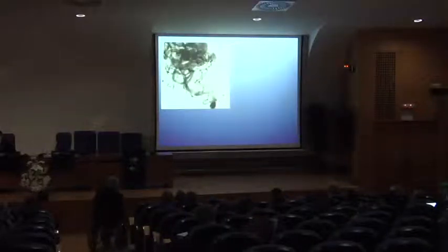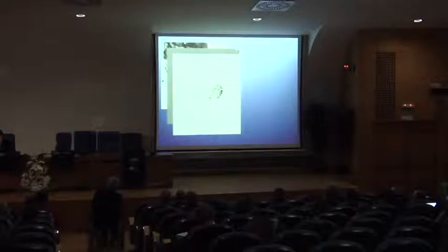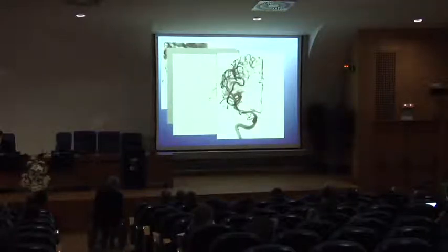Next. This is another example, very complex. It's possible to catheterize the lenticular artery with the balloon-assisted technique. Next. In this position, I decide to treat it with onyx. Normally, I treat it with glue, but in this case, I treat it with onyx. You have the cast of onyx in the deep part of the AVM. Next.